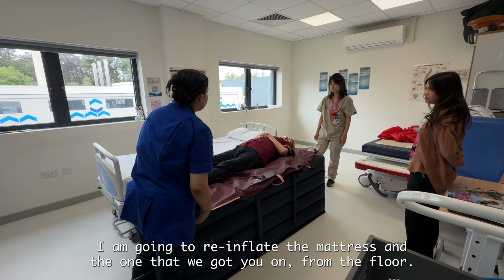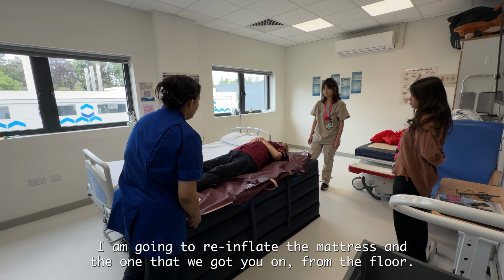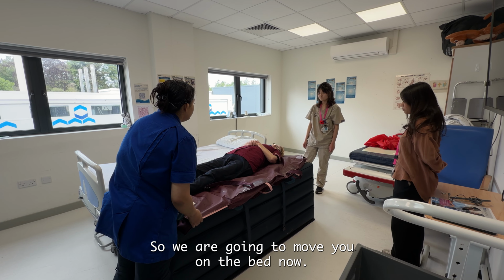I'm going to re-inflate the mattress, the one that we got you on from the floor, okay? Yes. So we are going to move you on the bed now.